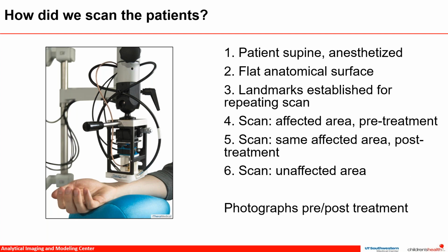Once a satisfactory scan was completed, the patient underwent their laser treatment by the surgeon. As soon as their treatment was completed, we brought the Rsom laser back to the patient and repeated our scan in the same spot that we scanned before treatment. We would then do an additional scan on an unaffected skin region in a similar anatomic area for comparison.